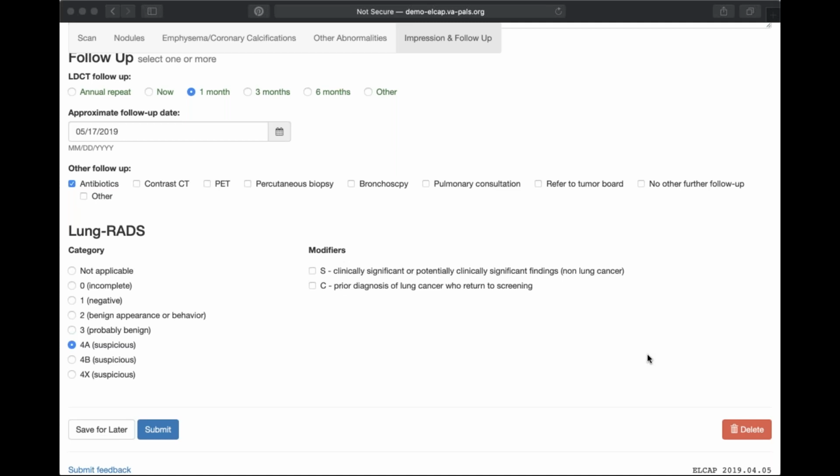I do know that at least one of the VA hospitals, they've tried to get it set up so that all low-dose CT scans go through their lung screening program. If they're able to make that stick, then all low-dose CT scans would be in the program, and so the radiologist would know.